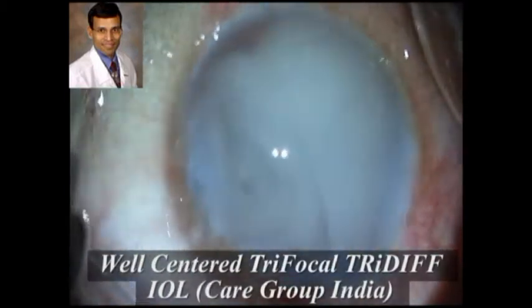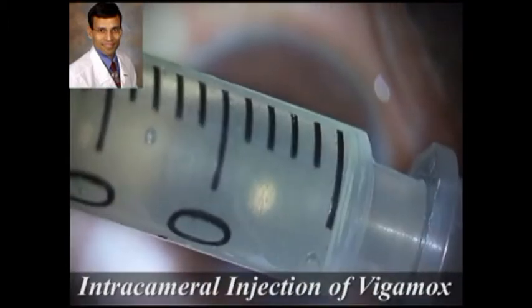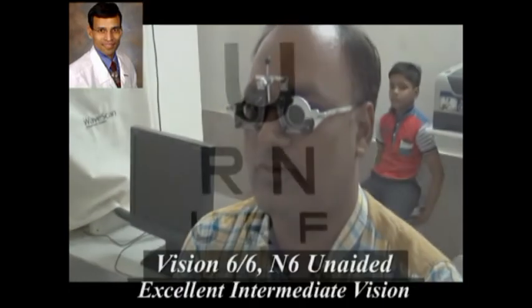Intracameral triamcinolone is being injected into the anterior chamber to minimize post-operative inflammation — this is of course an optional step. As we can see, the patient achieved very good vision post-operatively, reading 6/6 or 20/20 unaided for distance and near.